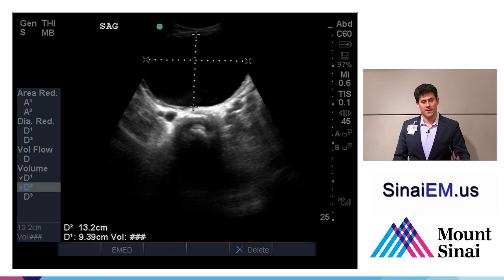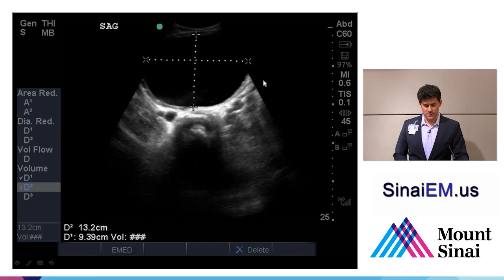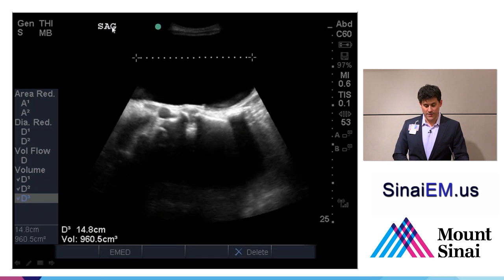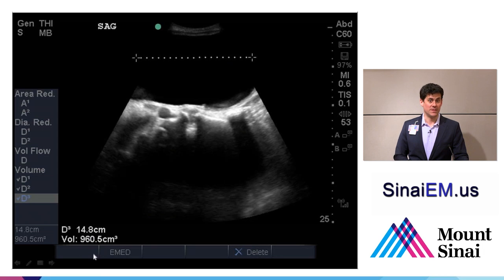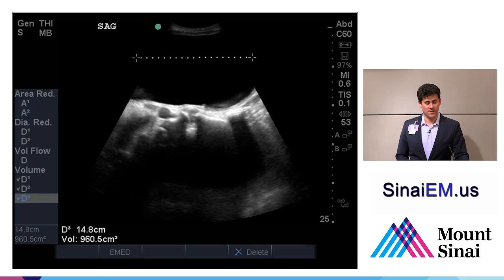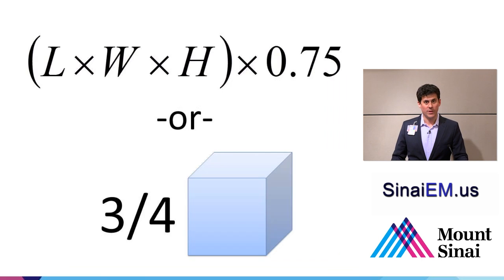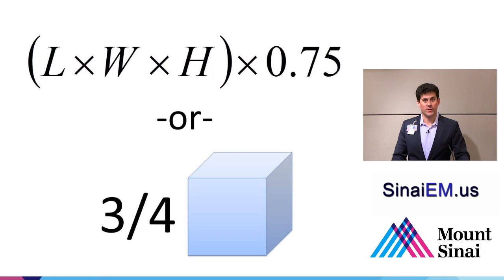Most machines can perform these measurements with the equation built in. In the transverse view we have anterior-to-posterior and left-to-right dimensions. In the sagittal view the bladder here extends off the edges of the screen, so it's at least 14 centimeters, giving a total bladder volume of at least a liter. You can use your machine's calculations area, or remember a simple validated equation: length times width times height times 0.75 — three-quarters of a cube — to get a good estimate of bladder volume.